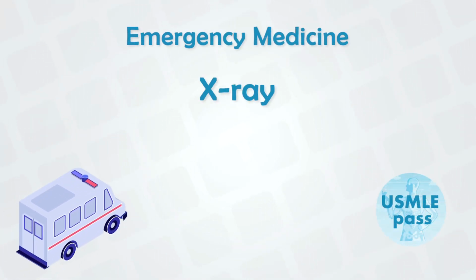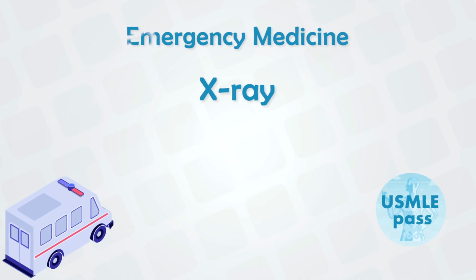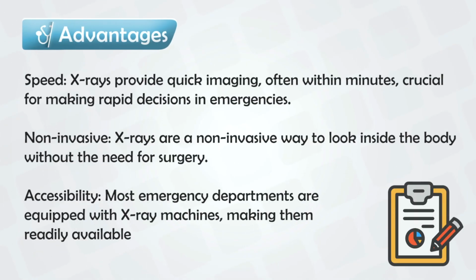As an ED physician, you need to be very familiar with X-rays because you will see it and use it all the time in the ED. It's a relatively cheap machine and it provides the results very quickly. You can see the images practically instantly, especially with portable X-rays. So if a patient has some serious emergency condition, you can see some alarming findings or red flags in the X-rays. It is also available pretty much everywhere.